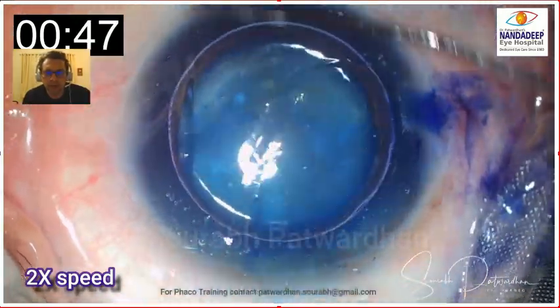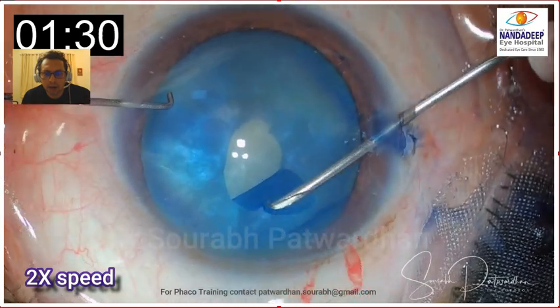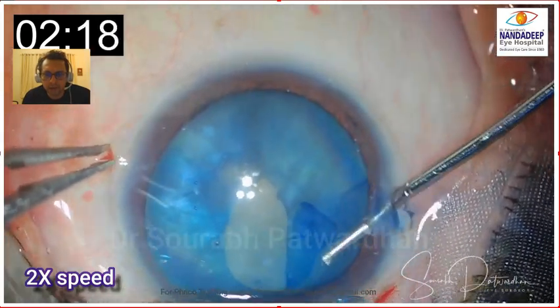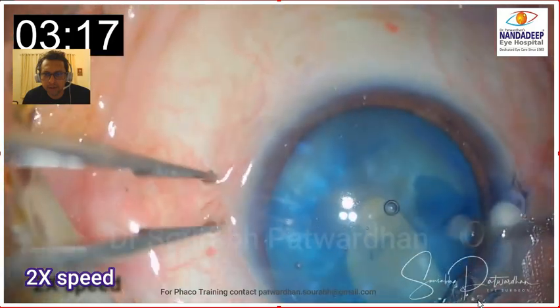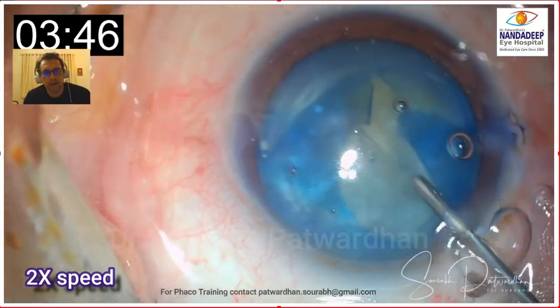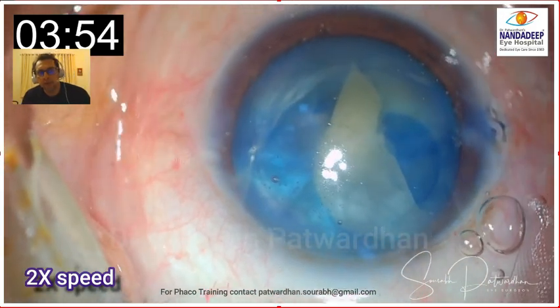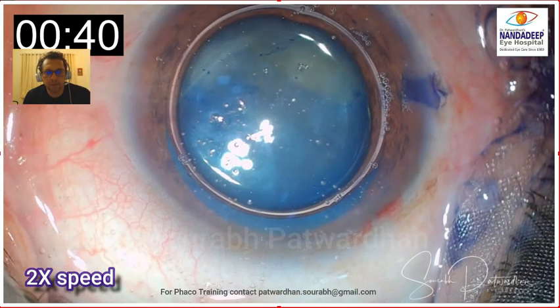In short, what happened: it was an intumescent cataract to start with. The capsule was stained, then the first nick was made, and this first flap, when the colleague tried to get it back, got extended despite efforts. The surgeon tried to make another tear on the other side, and subsequently that too extended, and then there was a complete Argentinian flag sign. In this video, I'll give you my approach towards this particular case, step by step.